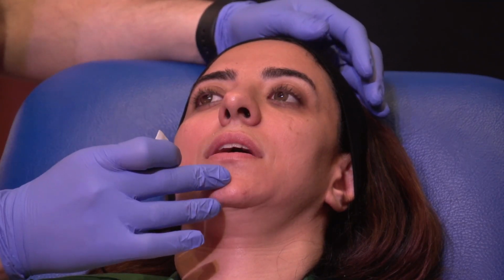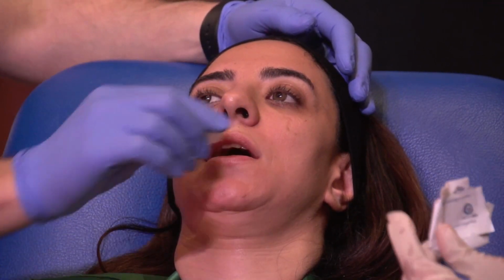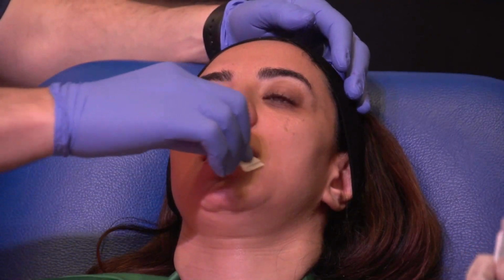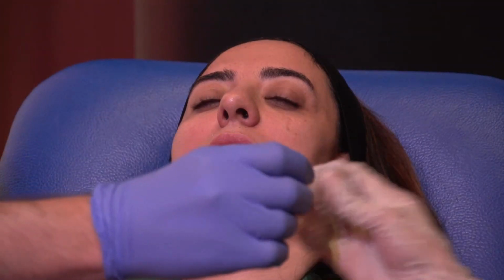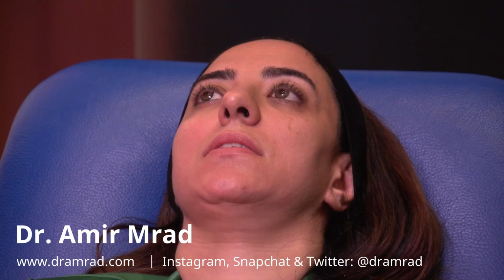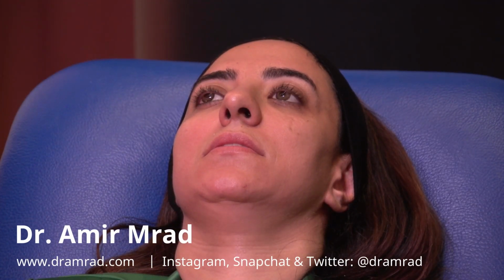So I asked her to part her lips a bit, and I also sterilize that mucosal wet and dry section, okay? In the lips, I'm extra cautious again about infection from the intraoral. It's a dirty area. I know that because of my surgeries on the angle of mandible, I go through the mouth, so I'm very, very meticulous with the mouth. Sometimes you need 3 or 5 injections on the lip to spread your product. I would sterilize after each injection.